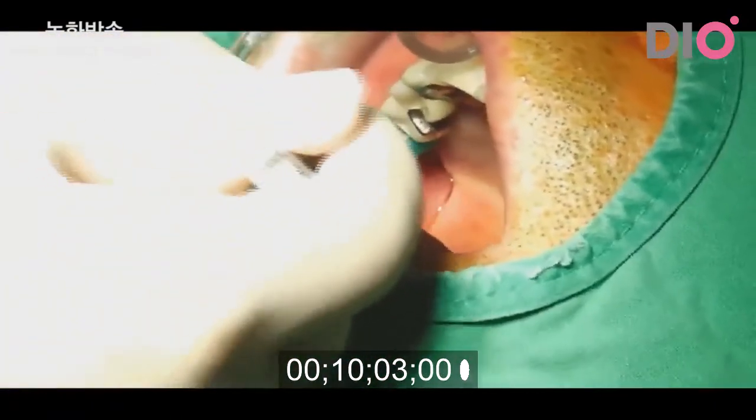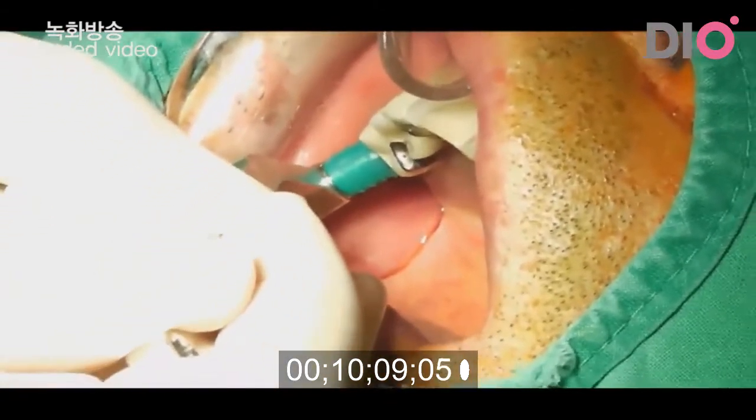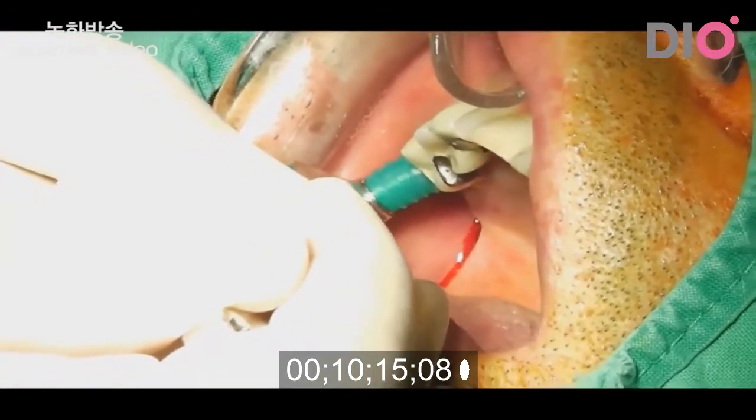first molar area. Okay. He started injection. He injected 0.5 milliliter.